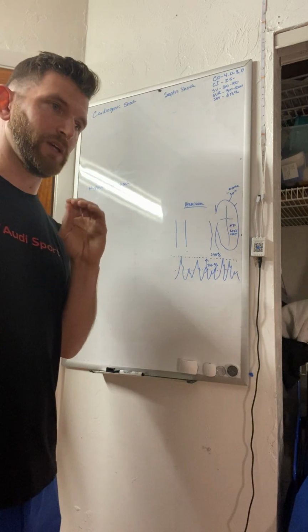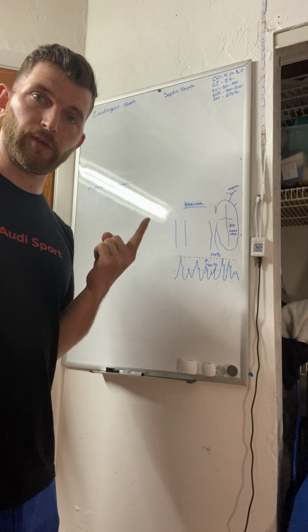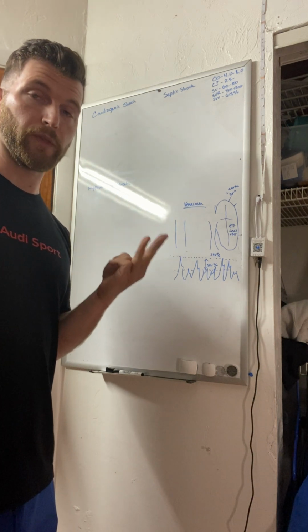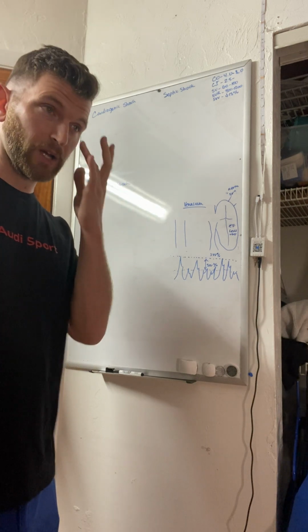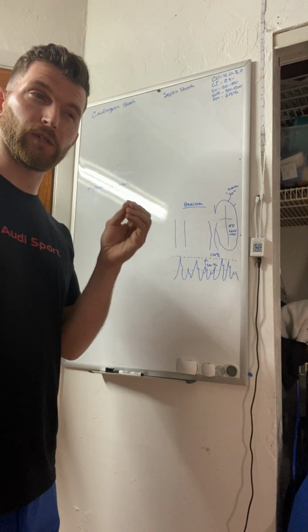It's not to be taken literally every single time. You also have to judge factors like, is this patient breathing on their own? Are they getting adequate tidal volumes with every breath? Are they in a normal rhythm and a normal rate? Are they paralyzed? Ideally, either well sedated or paralyzed, because that's going to be the most accurate numbers.